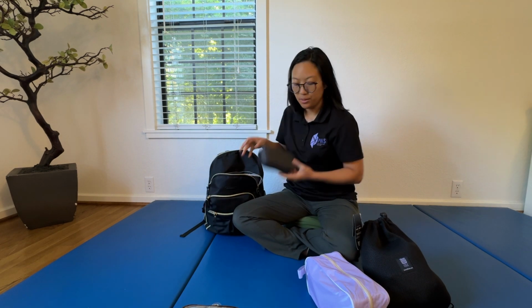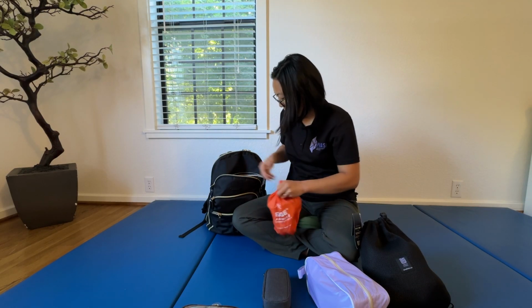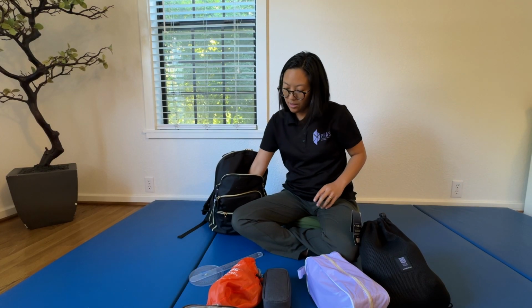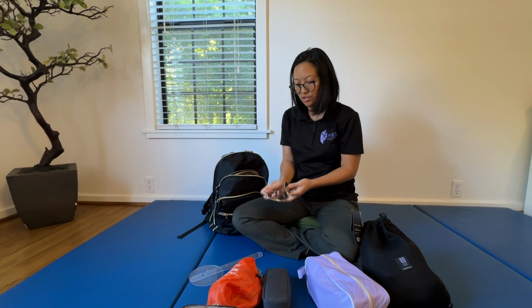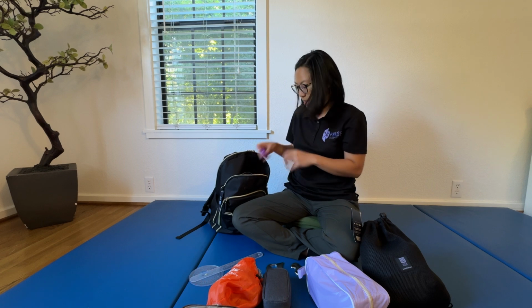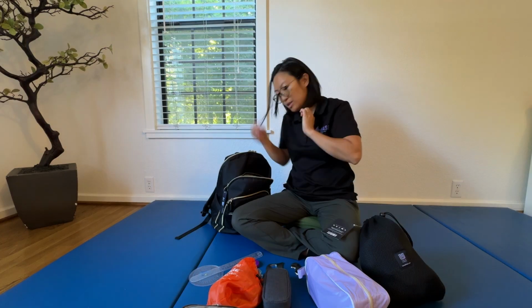I've got my blood pressure cuff. I've got my dynamic cups and cream, and I've got my goniometer. And I've got a couple of my instrument soft tissue tools, Graston tools specifically for these ones, if I'm ever needing to do more deep soft tissue work. I'd like to get some other ones, but that's just what I have for now. And then I also have a tape measure when it is needed. So that's pretty much it.